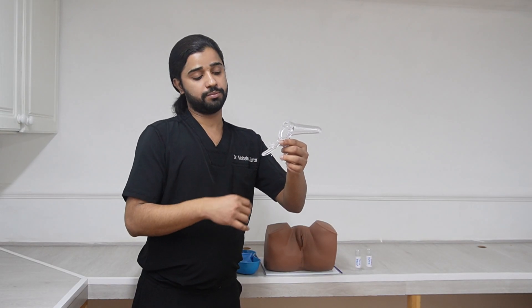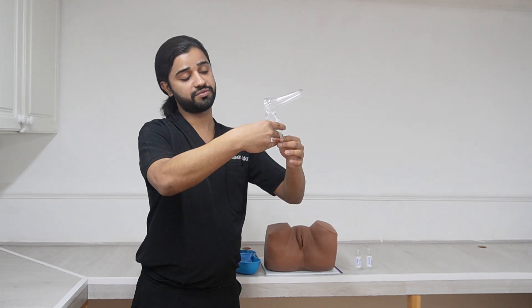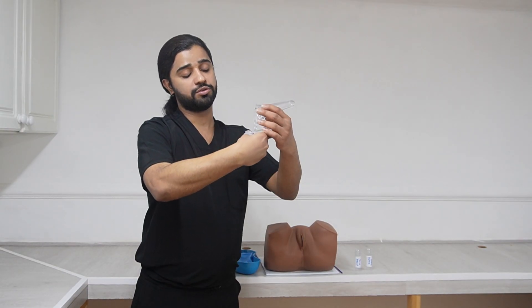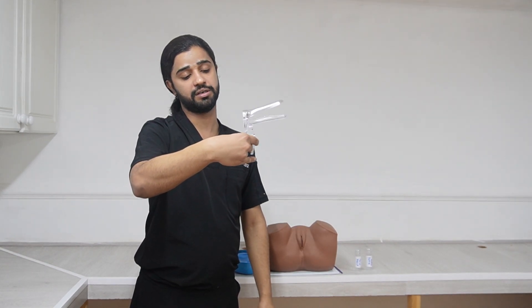So how to hold this speculum: your thumb should be at the back handle, your ring finger here, and at the front handle your middle finger and index finger should be placed so you can open and close it. It should be in your control — thumb and ring finger on the back handle, middle and index finger on the front handle.